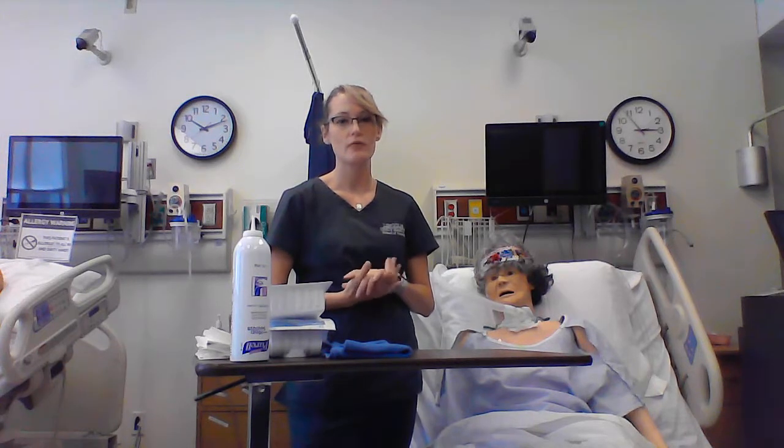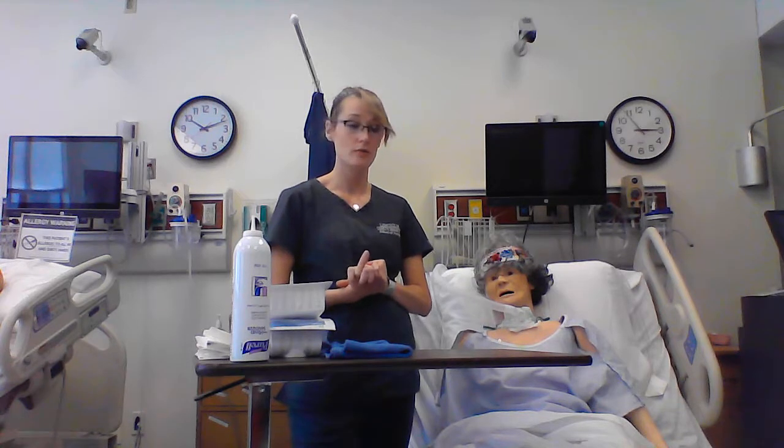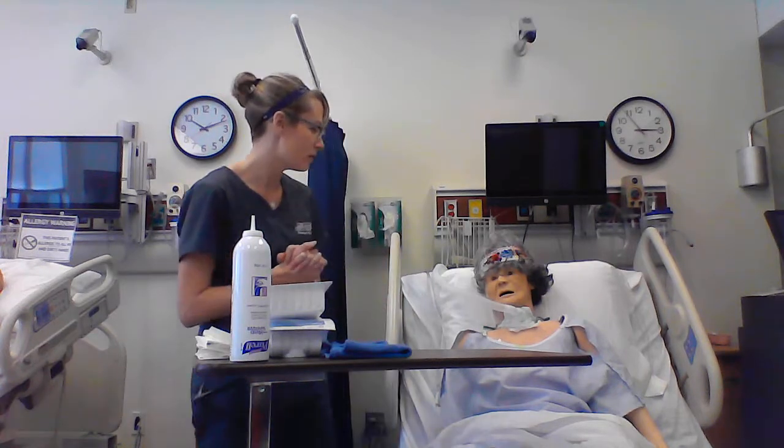My name is Tracy Cundiff. I'm a 7th semester nursing student. I'm here to perform tracheostomy care and suctioning for a patient. It is September 23rd of 2019, and this is Opal Pearl.